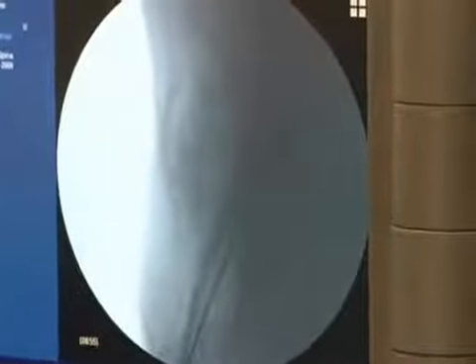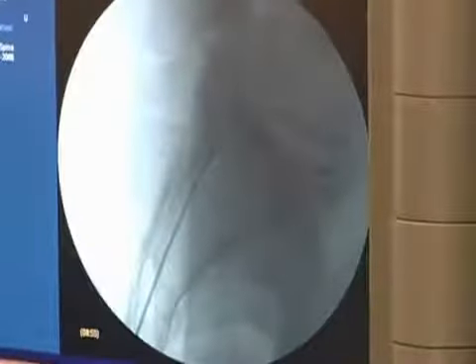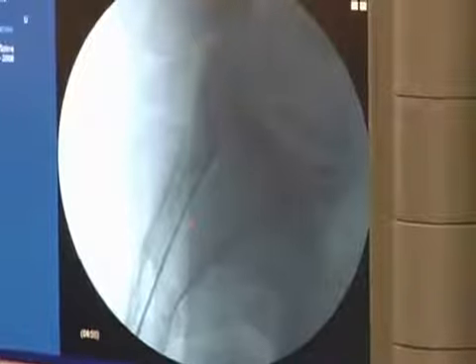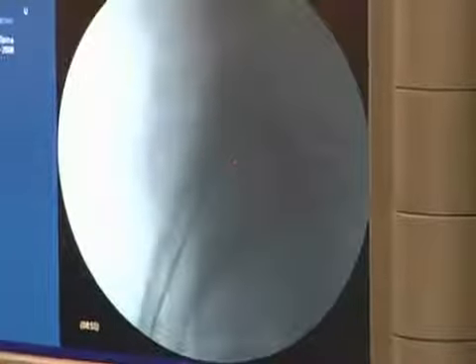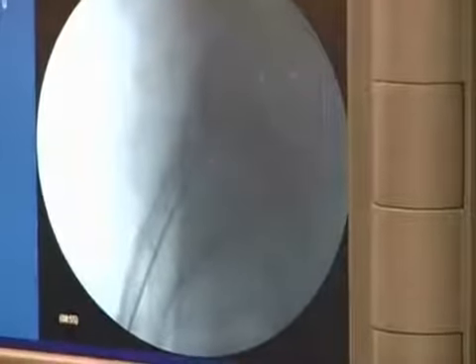This is so easy. Okay. And let's get a true lateral here, so let's see which way we need to go. Okay, let's split. I'll come back right there. And let's get a penetrated view. Top of the disc. You don't want to be at. No, that's right where you want to be.